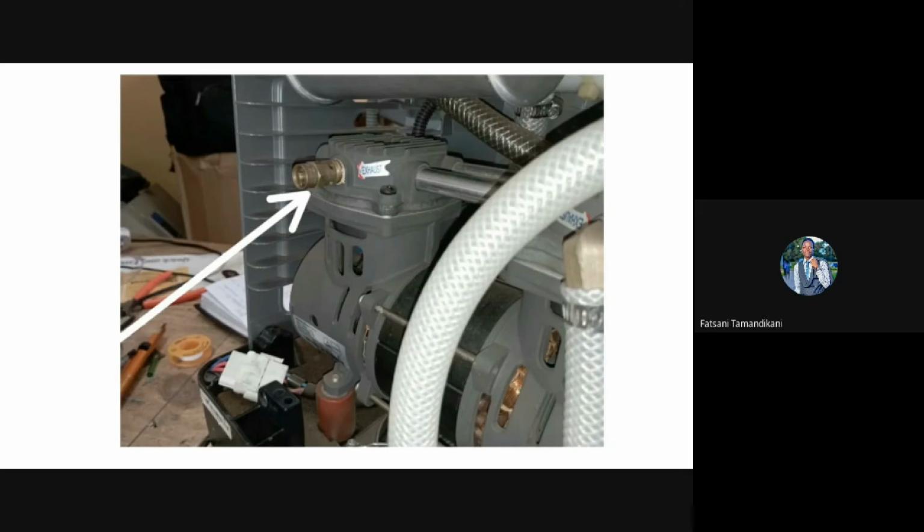As you know, a relief valve is an example of a one-way valve, and each and every one-way valve has what we call a cracking pressure. That is the pressure at which flow can be detected. In most concentrators, the relief valve is triggered at a pressure ranging from 40 to 45 psi. The relief valve popping indicates that the air is not flowing as quickly as it should in the pneumatic pathways. Thereby, it causes a pressure buildup in the compressor, and this can cause the relief valve to open.